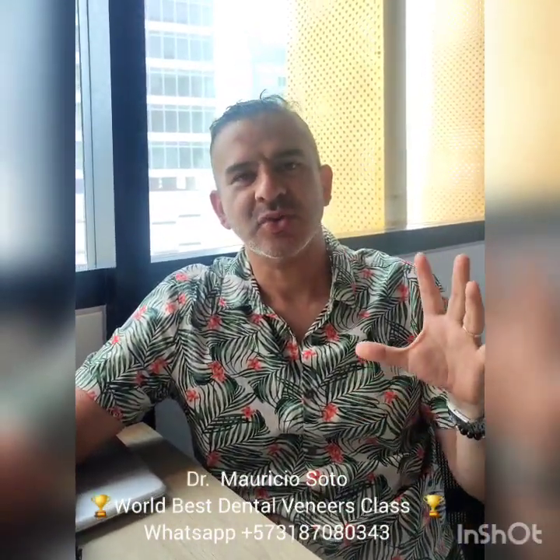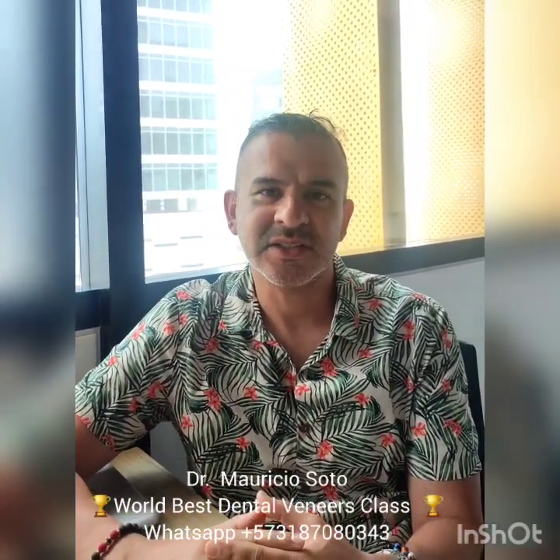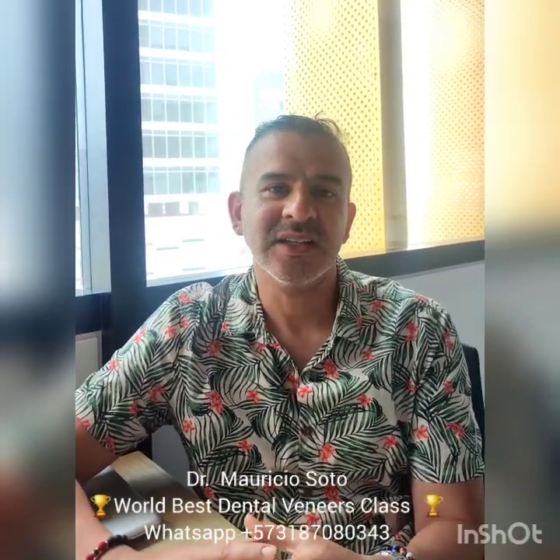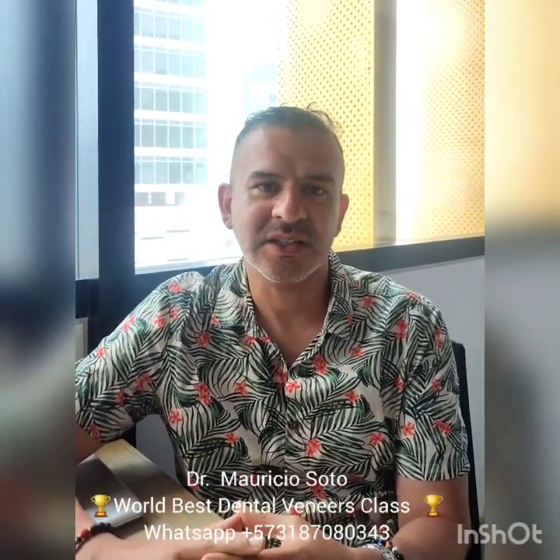Hello everybody, I'm Dr. Mauricio Soto again, and today I want to show you in this video how to repair composite veneers easily. Remember that one of the advantages of composite veneers is that you can easily repair them if the patient accidentally chips the veneers. I'm going to show you how to do this in an easy and fast way.